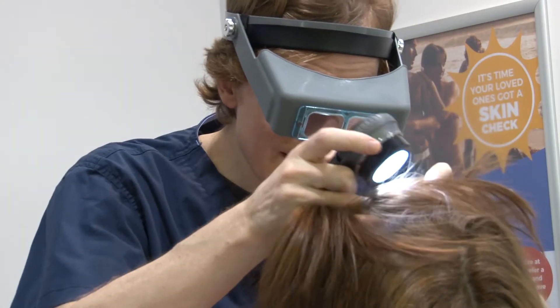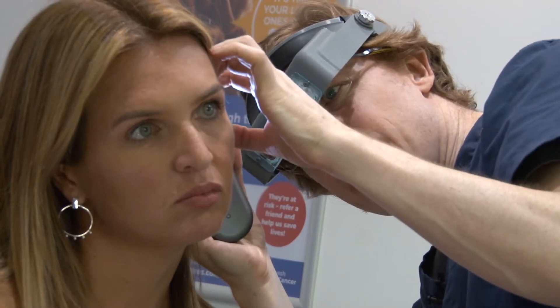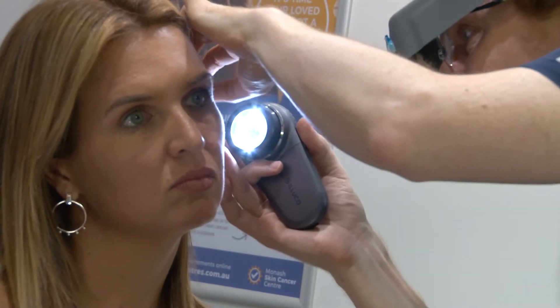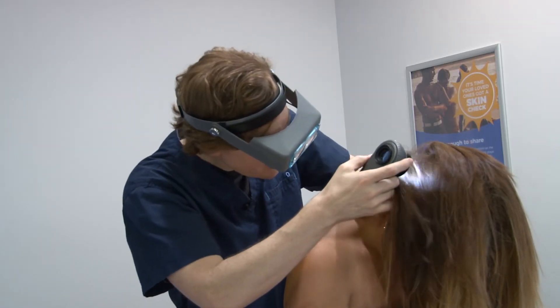Then I run behind the patient and try and get them to fling their hair over the fringe and just rifle through there, looking at the back of the right ear, back of the left ear, and lifting the hair up to look at the back of the neck. That might take two and a half minutes, depending on how much hair the person's got.